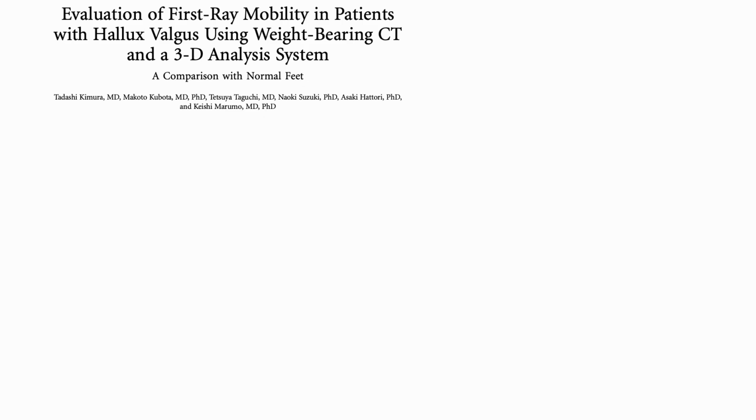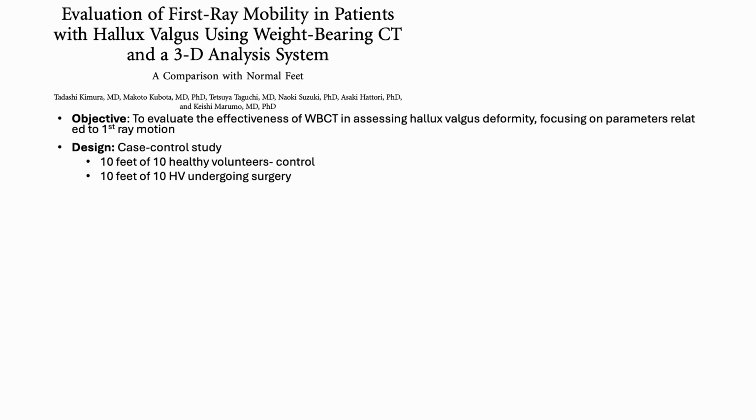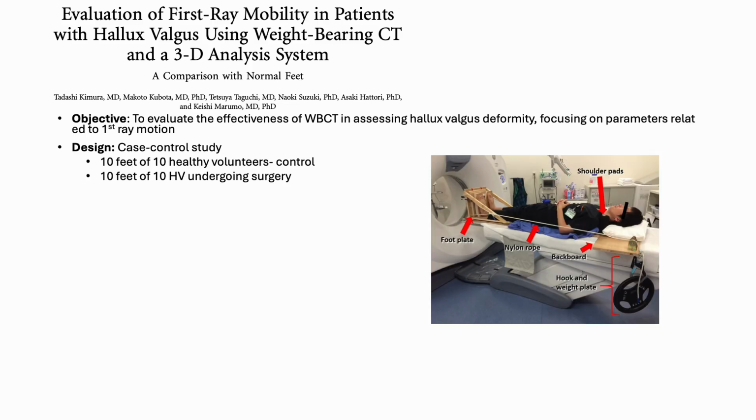These guys followed up using a simulated weight-bearing surface, and I'll show you this. And they wanted to find the weight-bearing parameters. This is again simulated. This is not exactly a weight-bearing CT scan. Obviously, you guys can see that.